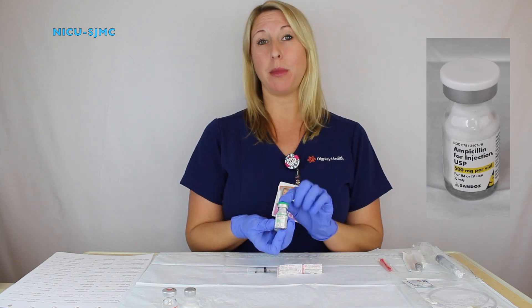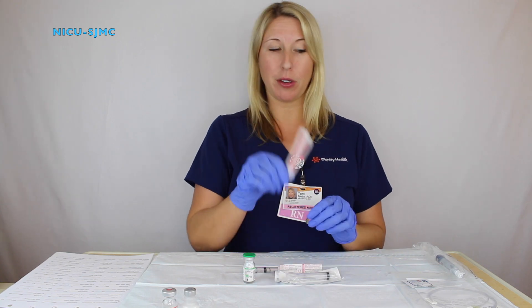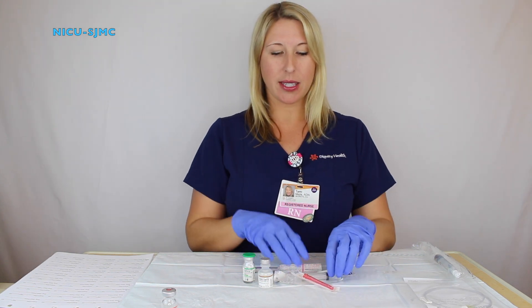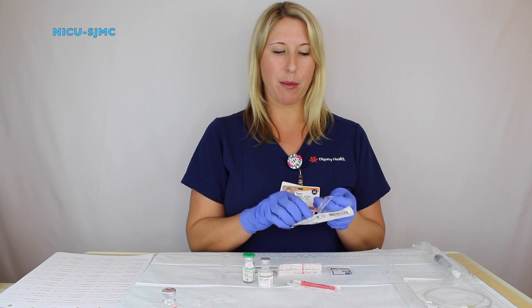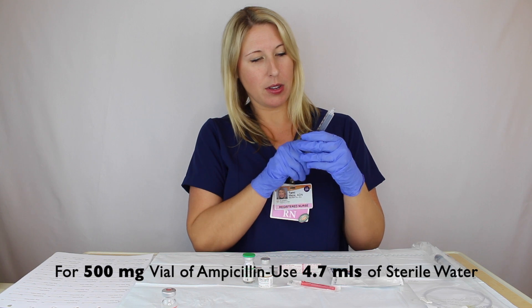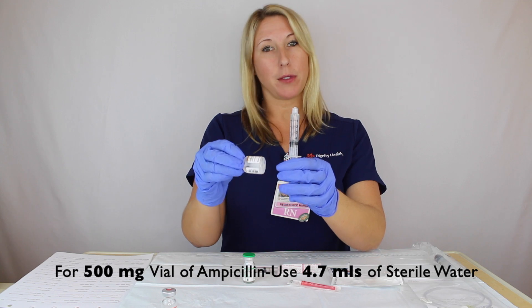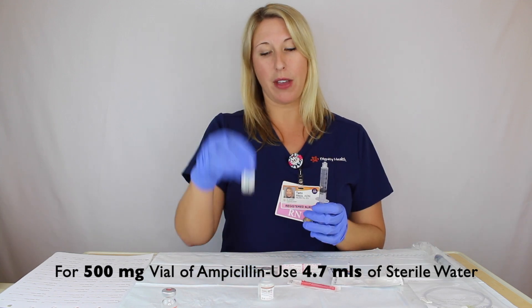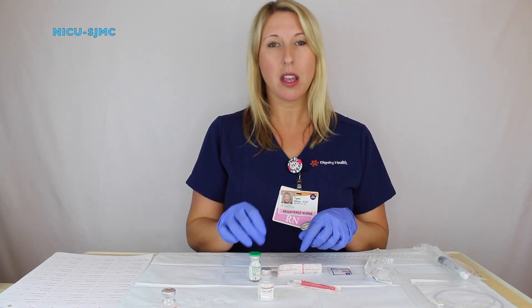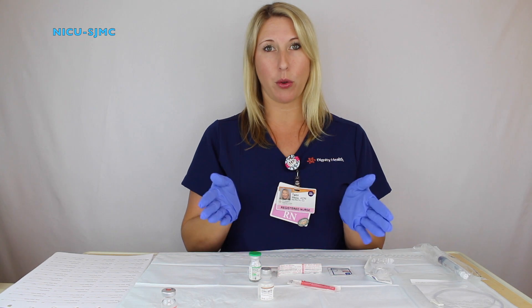When dealing with a 500mg vial of ampicillin, you will need a 5ml syringe, a blunt fill needle, sterile water, and two alcohol prep pads. Same process except you will fill your 5ml syringe to 4.7ml of sterile water for your 500mg ampicillin. If you cannot remember concentrations of sterile water to ampicillin, there is a laminated copy posted just above the medication preparation station for your reference.